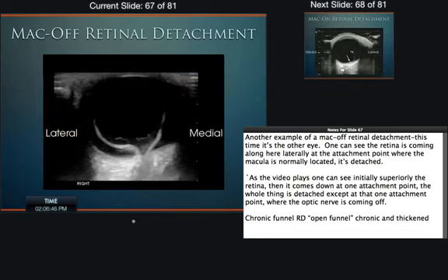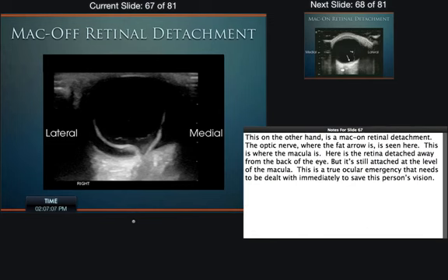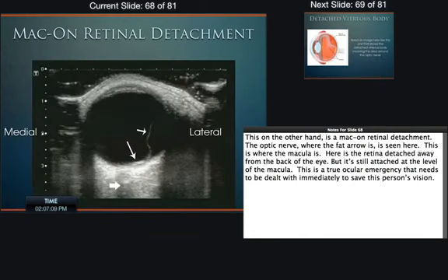And as we fan through the video, it's kind of interesting. I like how you can see how it's tethered right down there. See how it just comes down and boom, it locks in right here at that optic nerve sheath. And it gets tethered up here at the ora serrata on both sides. That's a very classic looking MAC off detachment. Most of the detachments we see, unfortunately, are MAC off detachments. That's an example of that MAC on detachment you saw from the earlier case.